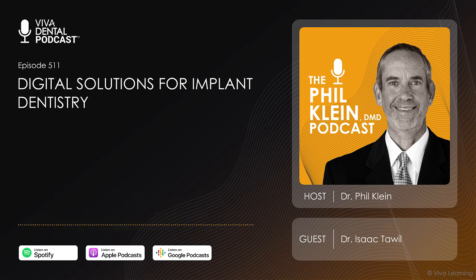So we've been printing both surgical guides, and what's been even more important to me is previously I used to fabricate teeth in advance and do some type of luting to the actual implants to our prefabricated teeth. And that would take some time in a workup. It might take us a month and a half to get these teeth in the office to do these cases.